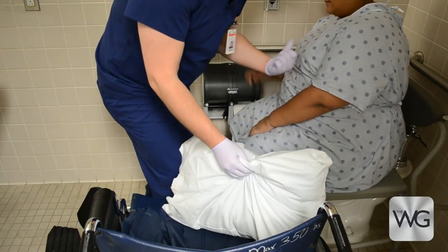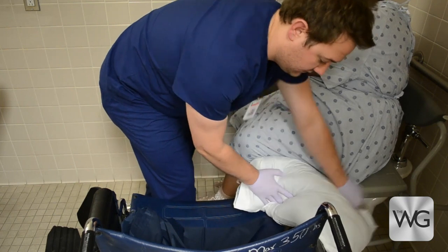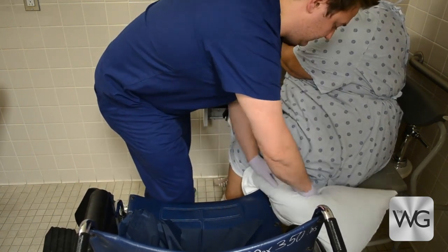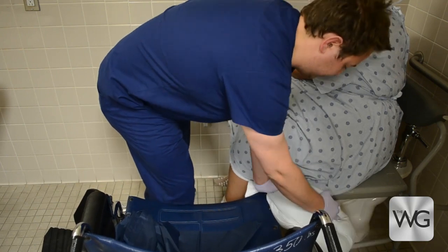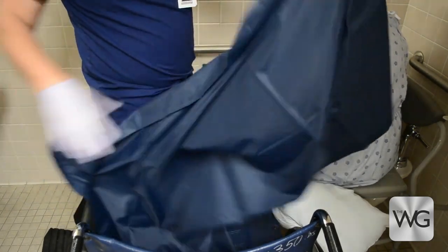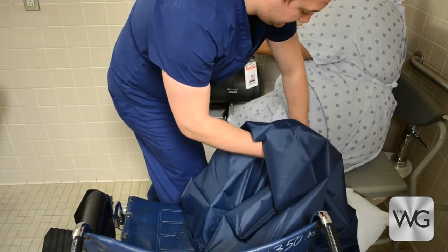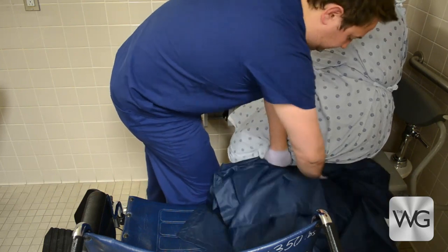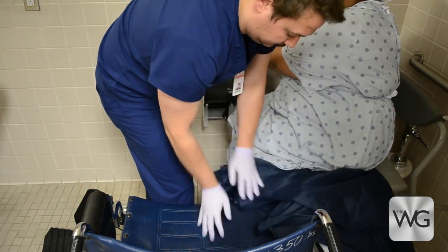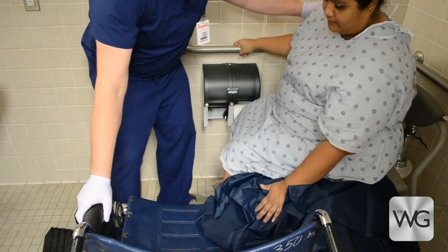A removable arm wheelchair is placed next to the patient and commode. The space or gap between the surfaces may need to be bridged using a seated slide board, pillow, or bed linen. Instruct the patient to lean toward the side, away from the direction of the transfer. A single slide sheet is folded in half and tucked under the patient from buttock to thigh. Once tucked, the remaining slide sheet is moved away so the patient may place her hand on the wheelchair.